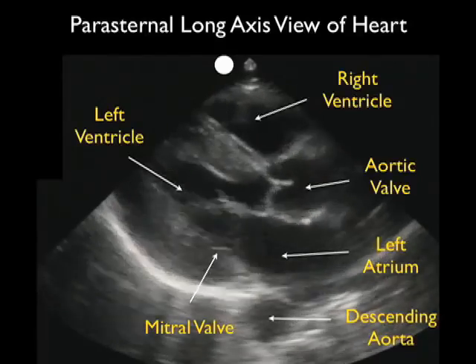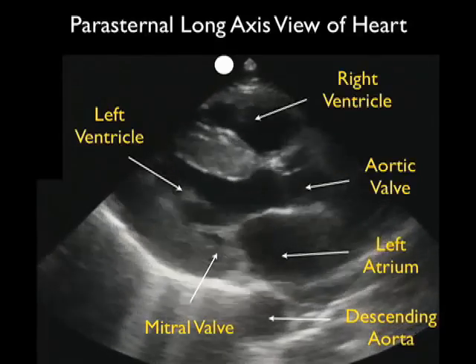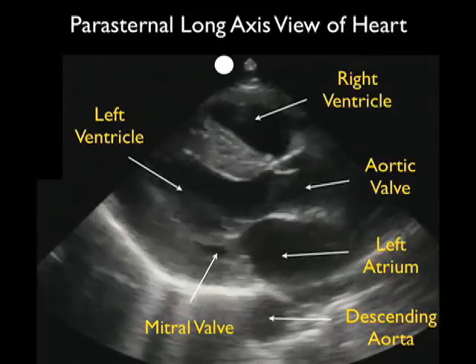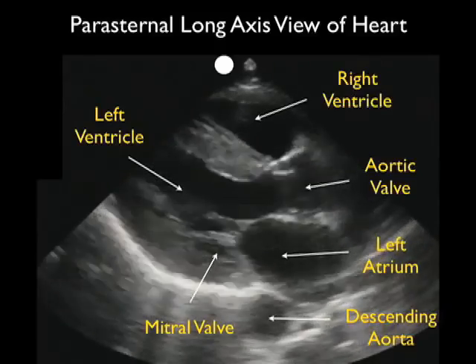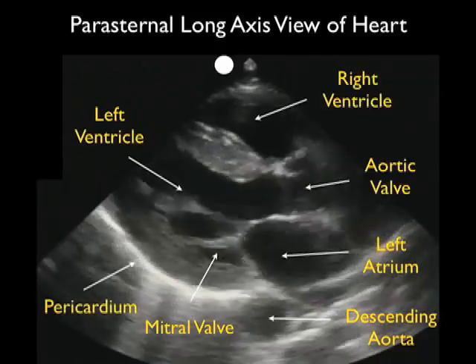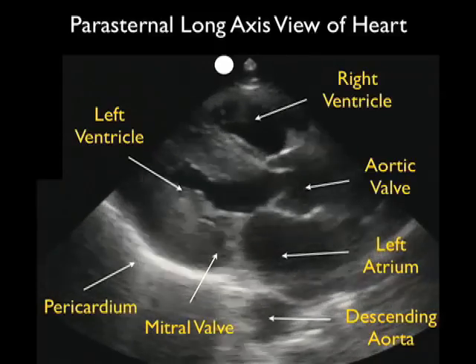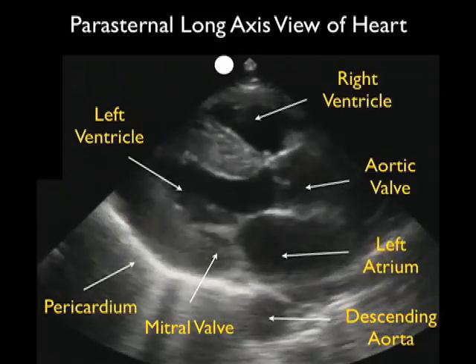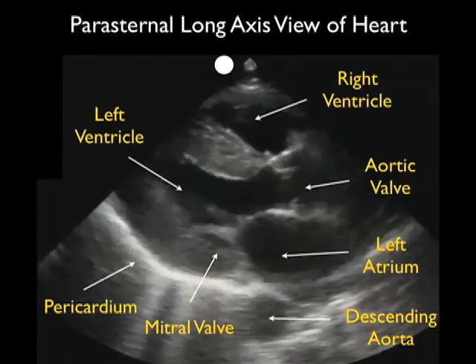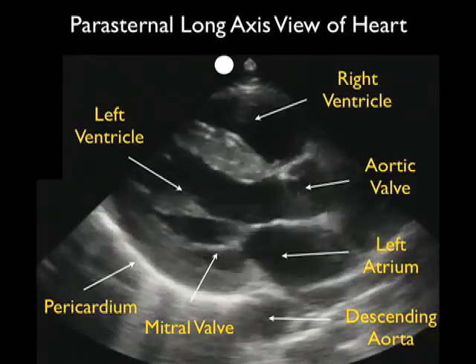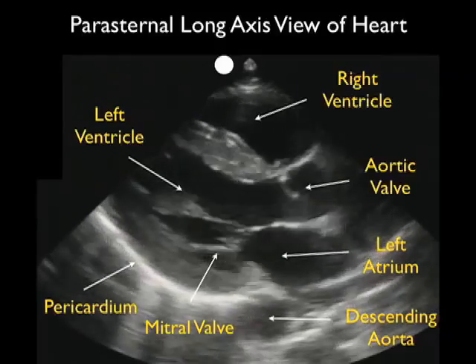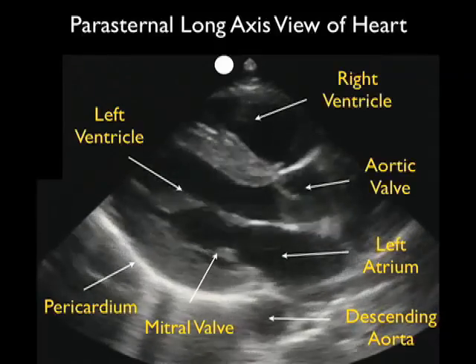Another very important structure to identify on bedside sonography is the descending aorta, which is a cylinder cut in cross section right below the mitral valve as seen in this image. This is a very important landmark because the posterior pericardial reflection — that white line seen posterior to the left ventricle — comes off anterior to the descending aorta. This allows us to tell if the fluid that we see there may be pericardial or pleural.